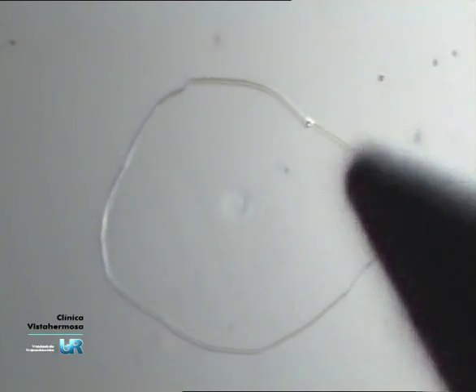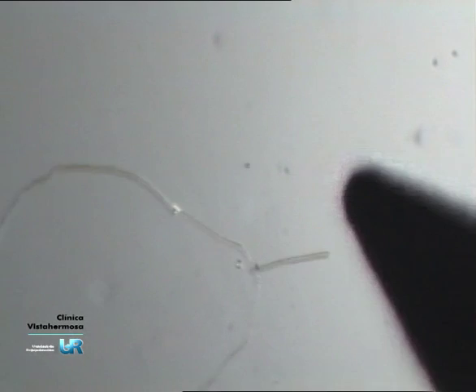It is essential to realize a circle around the fixed nucleus and to write a number that identifies each embryo.